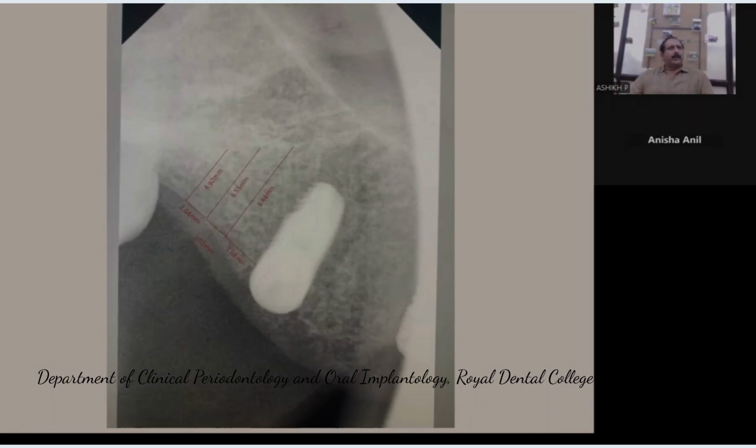Are you going to include your nearby implant in the incision? Nothing wrong in it. When was this placed? 9 months ago. Absolutely fine. So presently what you want is an exposed bone which will give you sufficient access to it.